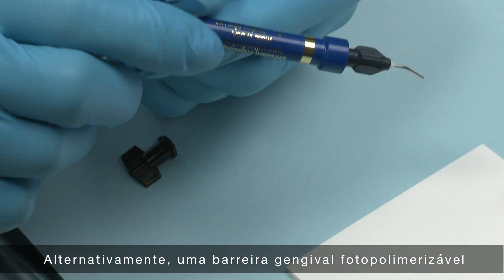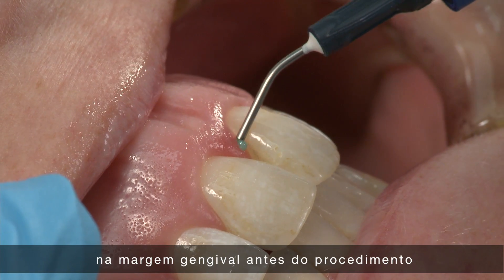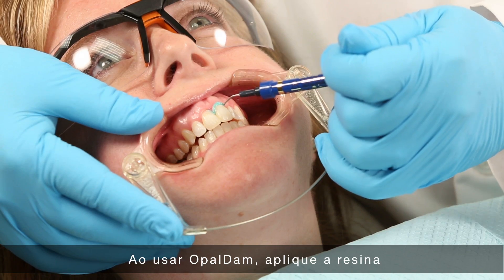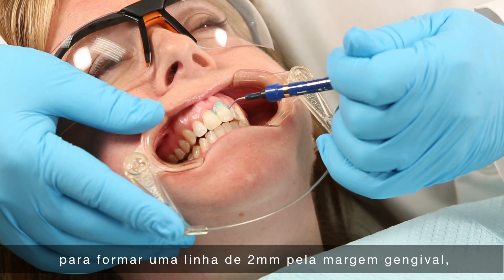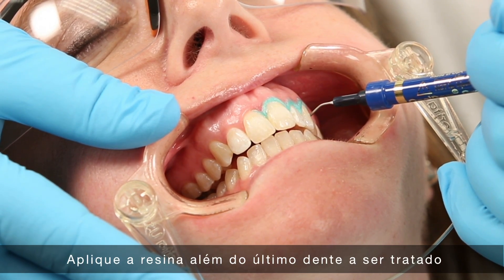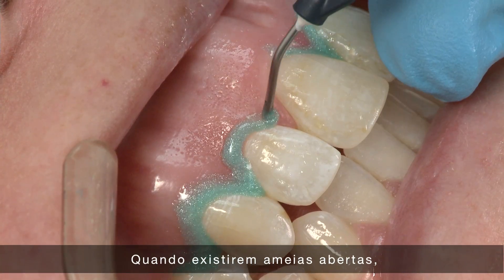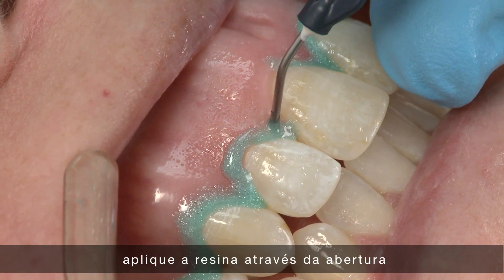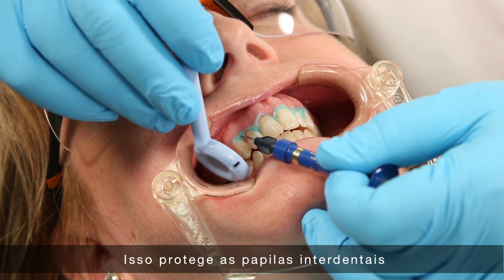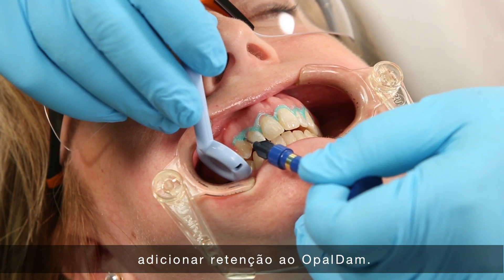Alternatively, a light-cured resin barrier such as Opal Dam can also be placed at the gingival margin prior to the procedure to prevent tissue damage. When using Opal Dam, express the resin to build a 2 mm strip along the gingival margins extending about 0.5 mm onto the enamel. Extend the resin beyond the last tooth to be treated. Where open embrasures exist, express resin through the opening onto the lingual gingival tissue. This will protect interdental papilla and lingual gingival tissue as well as add retention to the Opal Dam.